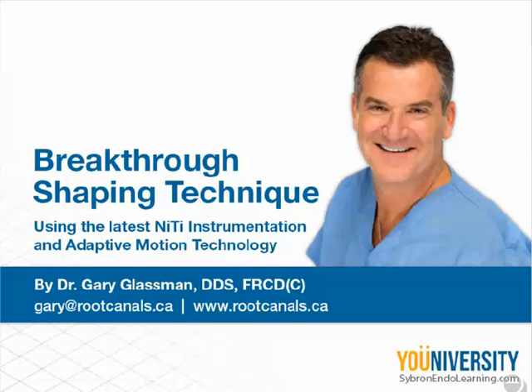I follow that with an irrigant of EDTA. I like to use Smear Clear. Smear Clear is a 17% aqueous EDTA solution that contains an antibacterial agent called cetrimide. It also acts as a surfactant, so it lowers the surface tension of the solution on the wall of the root canal. It also removes the inorganic component of the smear layer.